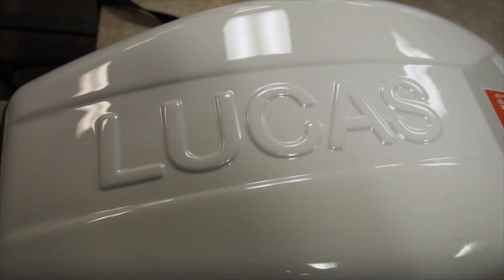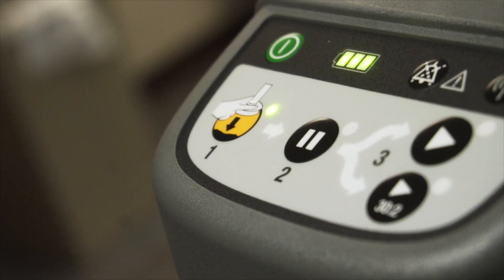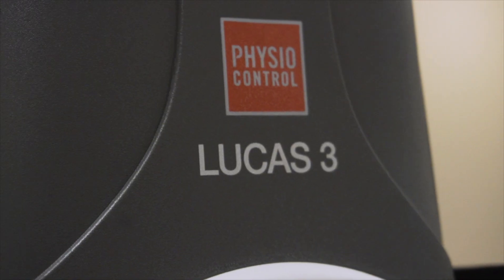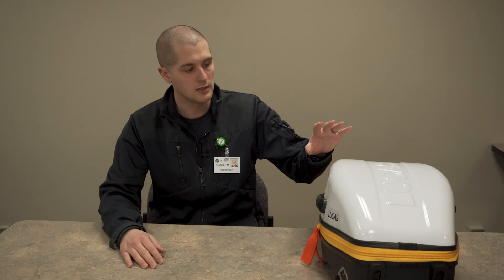Hi guys, my name is Sam. Today we're going to be discussing the Lucas 3 device. The Lucas 3 is a compression machine built to give chest compressions in the event of cardiac arrest for a prolonged period of time. It's a great device.